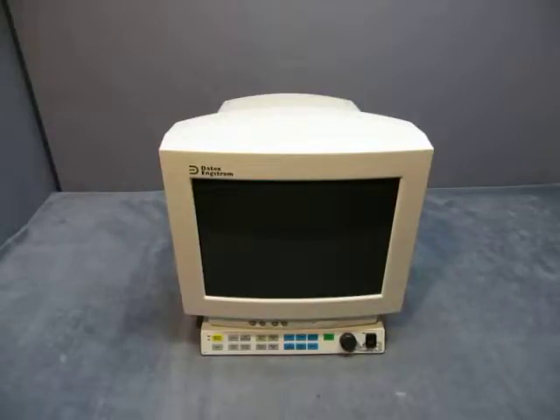For sale we have a Daytex Ingstrom Anesthesia Monitor. It comes with what you see here — the base and this.